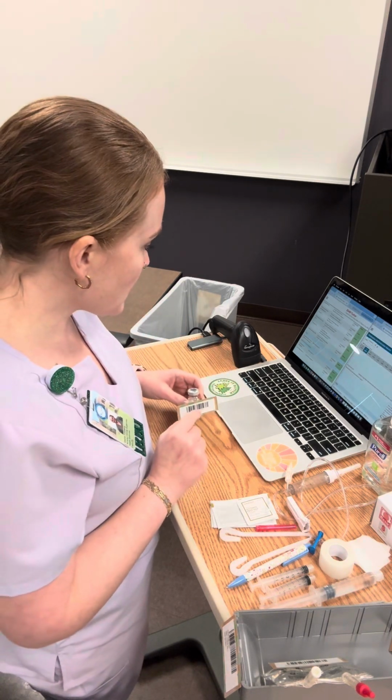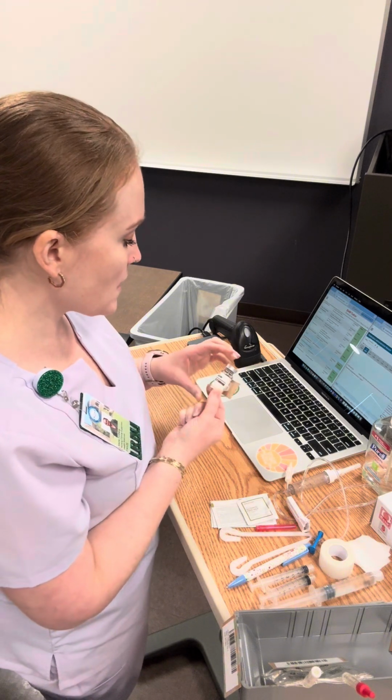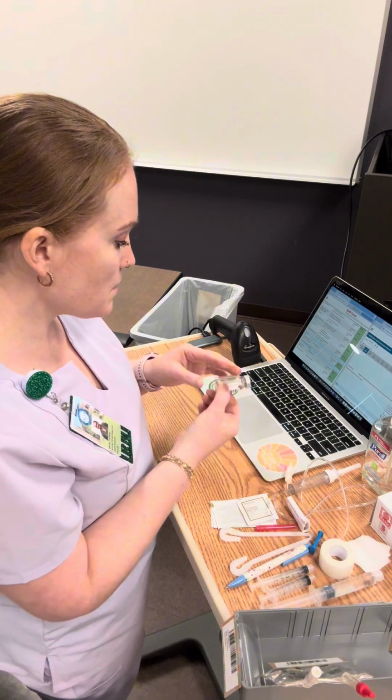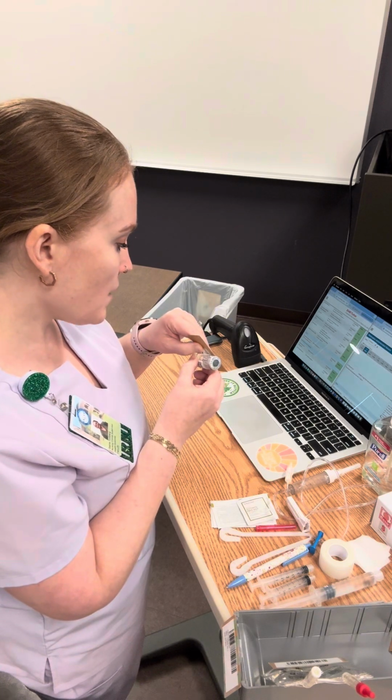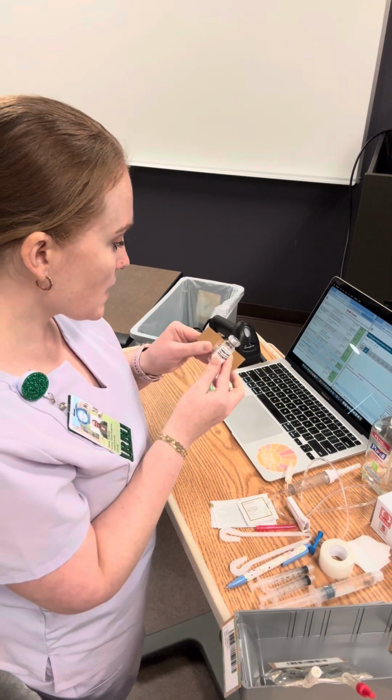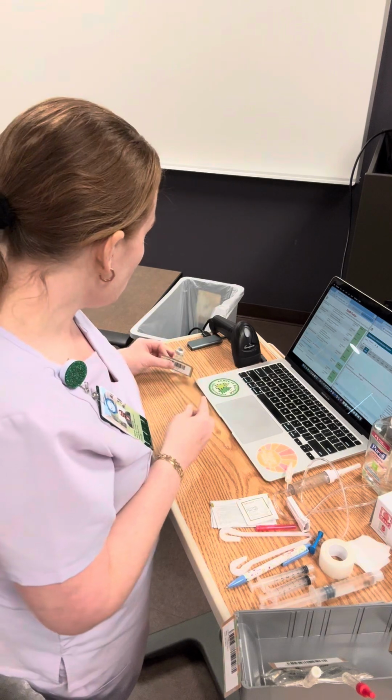So I'm going to set that down. Actually, before I set that down, I'm going to check the expiration date. It says July of 2030 and the vial is intact. I don't see anything impaired with it.